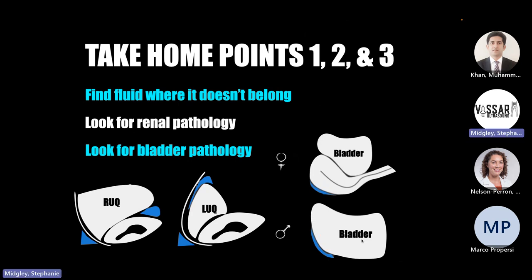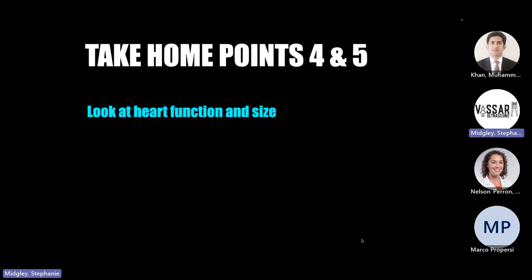Cool. So look for fluid, take a look at the kidney, look for bladder pathology, and then you're going to look at the heart for the function and size, look for effusion, and look at the IVC.